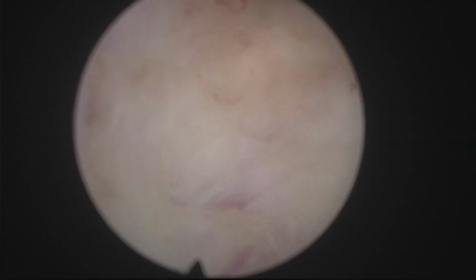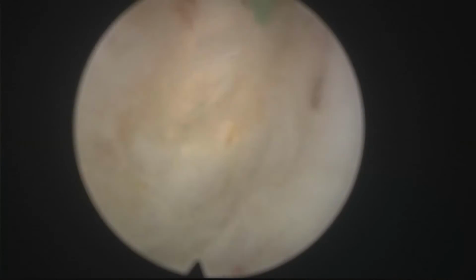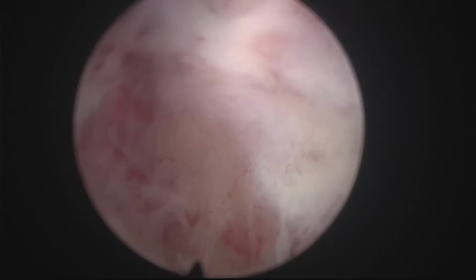And it becomes very, very familiar and very intuitive as well, because you are just going around the adenoma as if you were peeling an orange. Of course, nearing the bladder neck, we find more fibrosis. You see, tissues are hard, difficult to cut, but slowly we can progress.